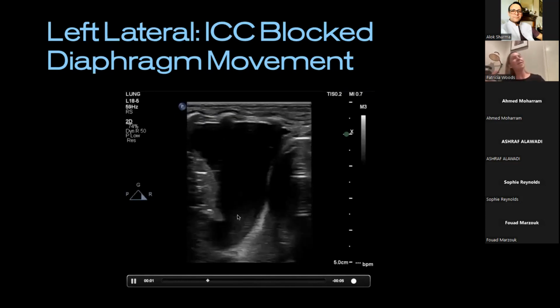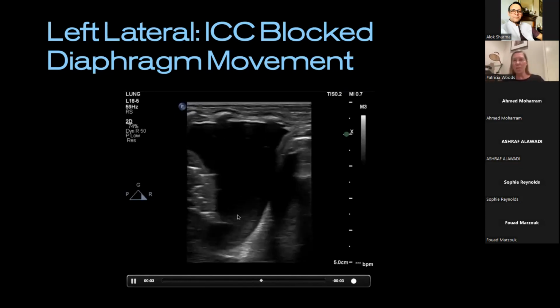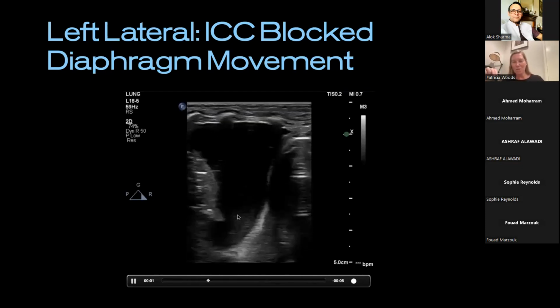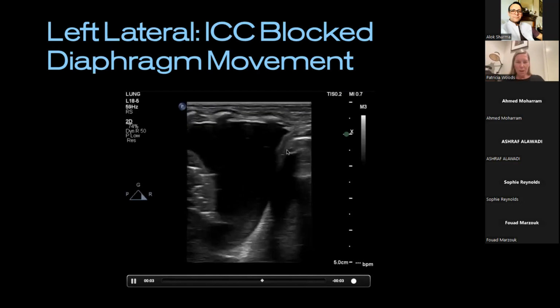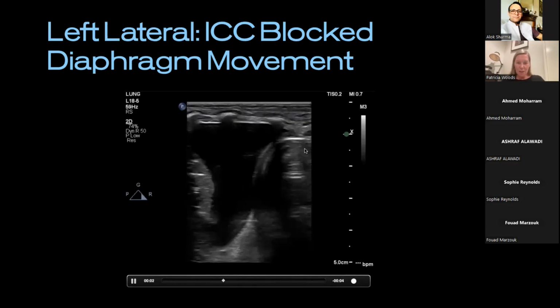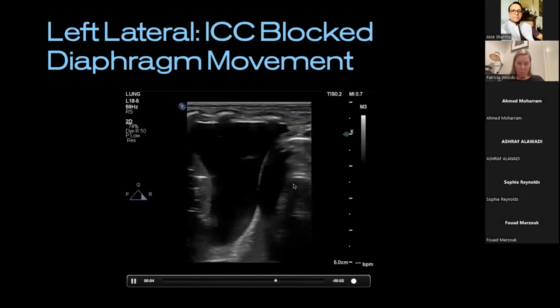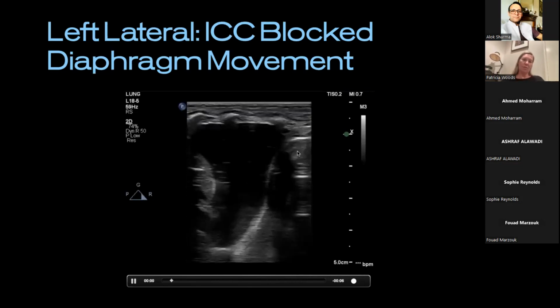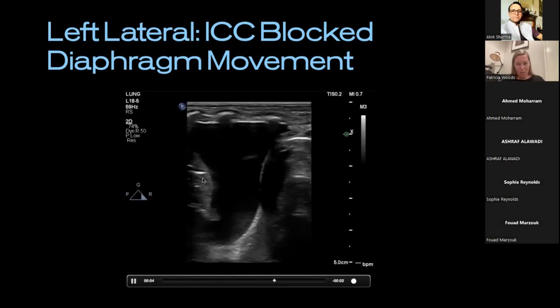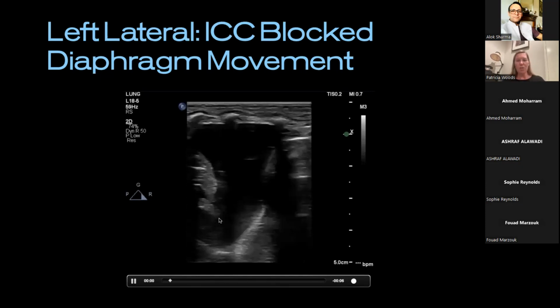When it's complex, you may see more fibrin strands and loculations, fine, but I can't tell you what the content of the fluid is. What I am observing here is this lovely movement of the diaphragm, aerated structure here, probably stomach, if not, large bowel or something. And again, this little wedge-like lower lobe of tissue.